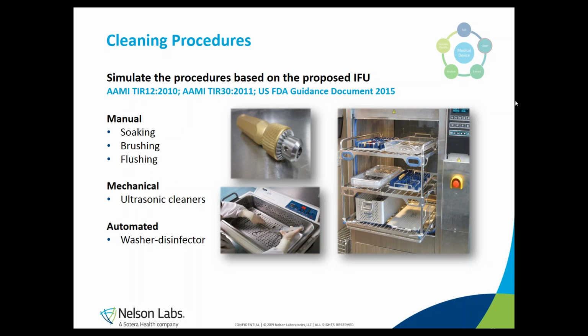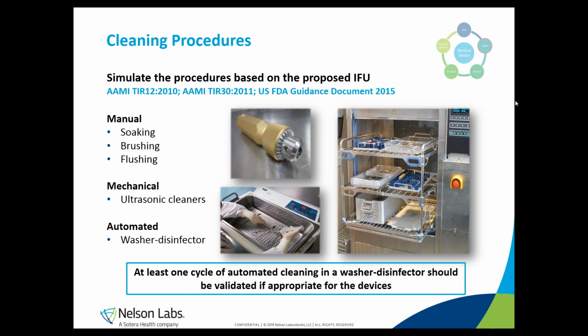And flushing, for example, can be used to clean small pinholes or lumens that may be present on a particular device. However, and keep that in mind, whenever the integrity of a medical device will not be compromised, it is obligated by guidances to have at least one automated cleaning cycle in a washer disinfector validated for that particular device.